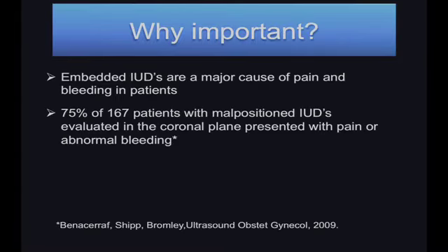Well, embedded IUDs are a major cause of pain and bleeding in patients. And Beryl Benacerraf and her group looked at 167 patients with malpositioned IUDs and found that 75% of these patients presented with pain or abnormal bleeding.